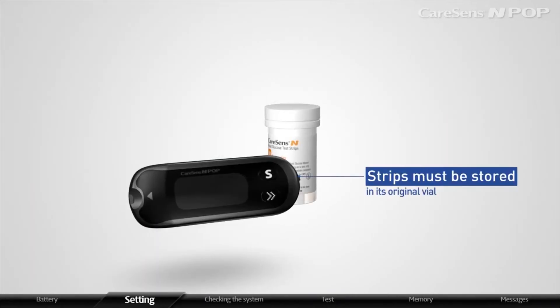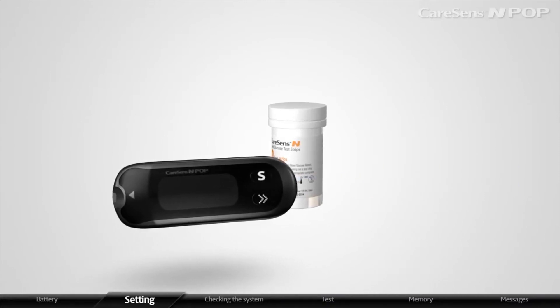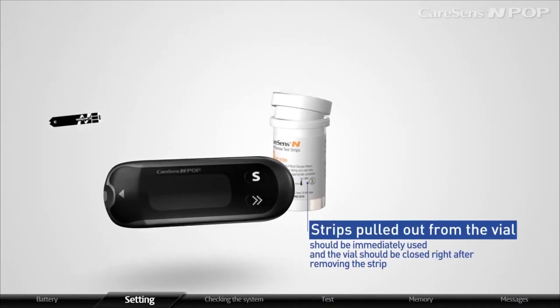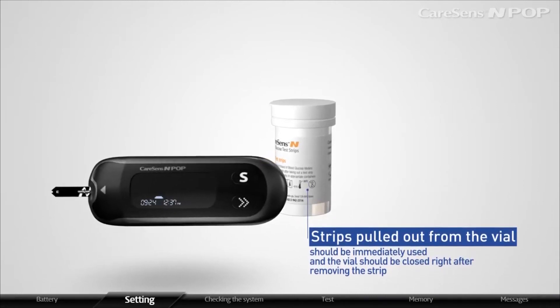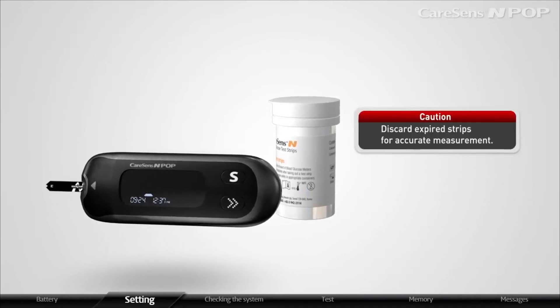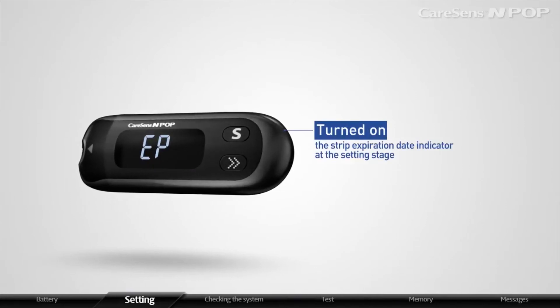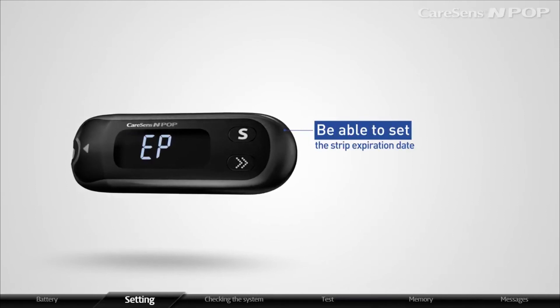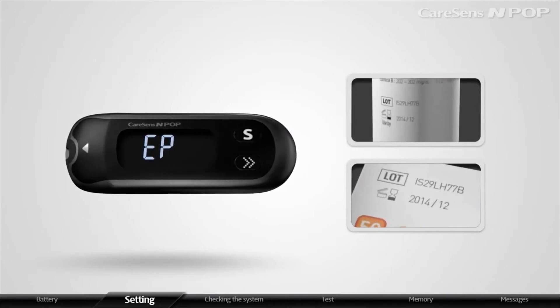Strips must be stored in their original vial and handled with clean and dry hands. Strips pulled out from the vial should be immediately used, and the vial should be closed right after removing the strip. Discard expired strips for accurate measurement. If you have turned on the strip expiration date indicator at the setting stage, you will be able to set the strip expiration date here. Strip expiration date is marked on the strip vial or box.